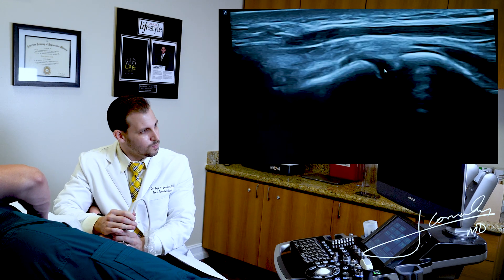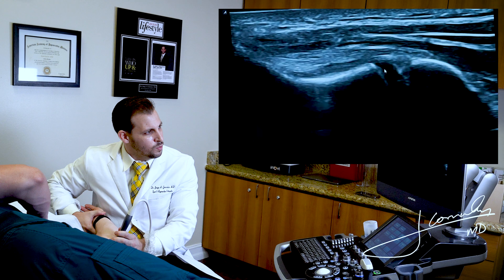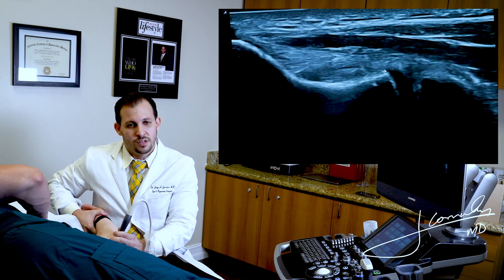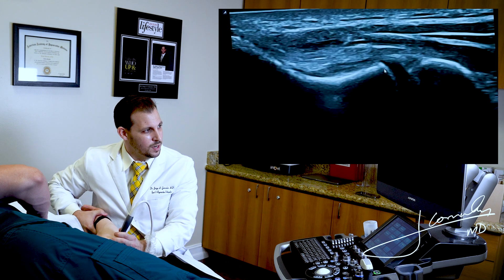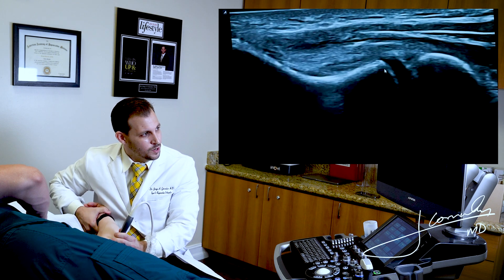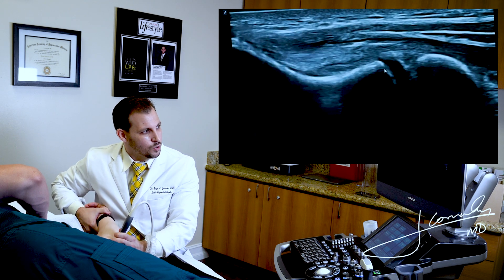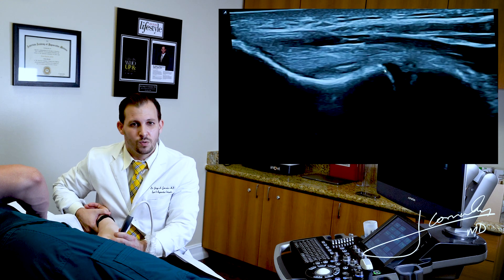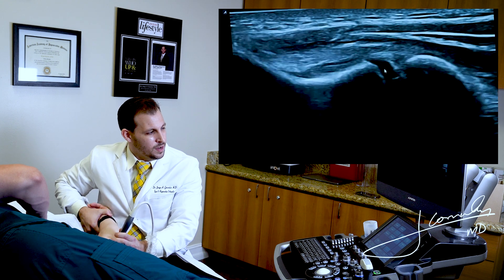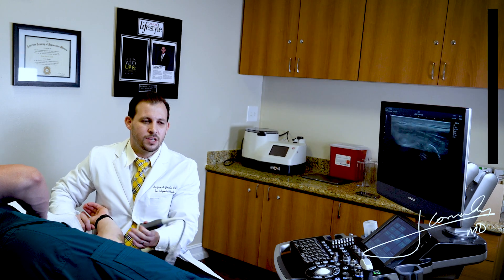There it is. At this point, we could do a dynamic valgus stress. I want you to concentrate right where the arrow is — that's the ulnar humeral joint space. This is an intact UCL because this athlete has never had an injury to this UCL, so there's going to be minimal gapping, what we call ulnar humeral joint space gapping. You could actually see some movement, but in an intact UCL this is what it should look like. In an injured UCL, that joint space gapping should open significantly more. And you could always measure the stress minus rest, which gives you a pretty quick and easy dynamic examination of the ulnar collateral ligament.